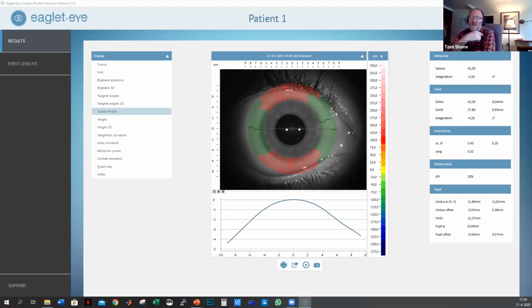It's pushing an hour, so I don't want to hold you guys too long, but we're here as long as you need. Ken Meller asks about the resolution. Standard, the difference that we keep is 100 microns. So it's checking each quadrant: is there more or less than 100 microns of difference compared to the other quadrants?